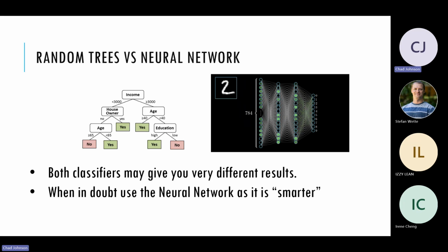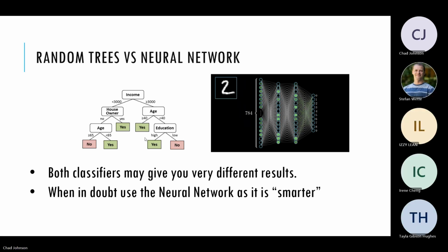So both classifiers may give you very different results. I've had the best results based on the neural network. So when in doubt, just use the neural network as it is, quotation marks, smarter.